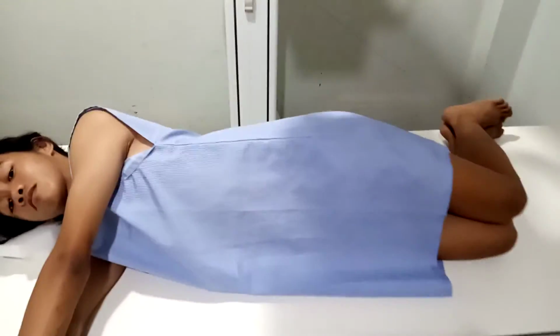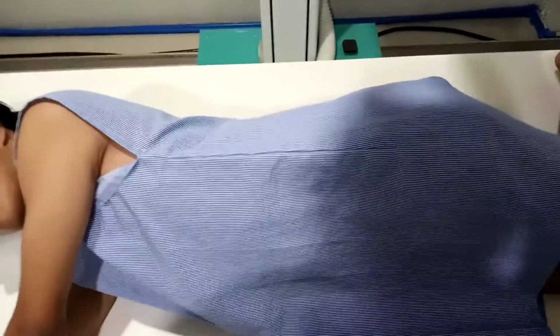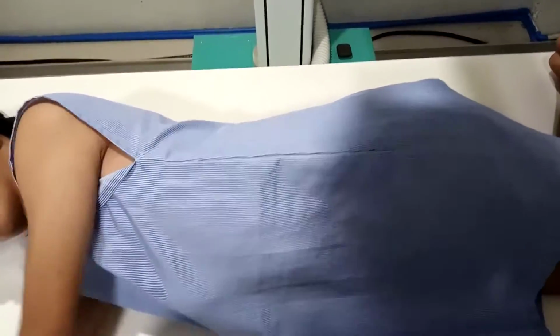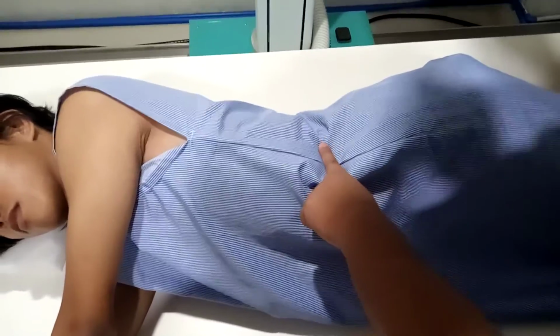Then, place the radiolucent support under the lower thorax. Adjust the spine parallel to the table. Then, always remember to shield the gonads before exposing the patient, because the gonads are sensitive to radiation. Then, instruct the patient to suspend breathing at the end of expiration before exposing. Then, the central ray must be perpendicular to the IR, entering the mid-coronal plane at the level of the iliac crest. This is the mid-coronal plane of the patient.